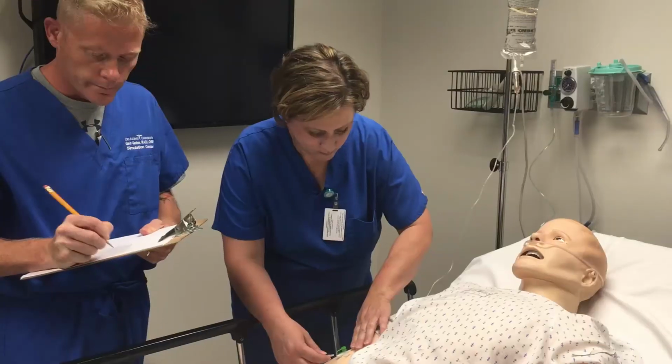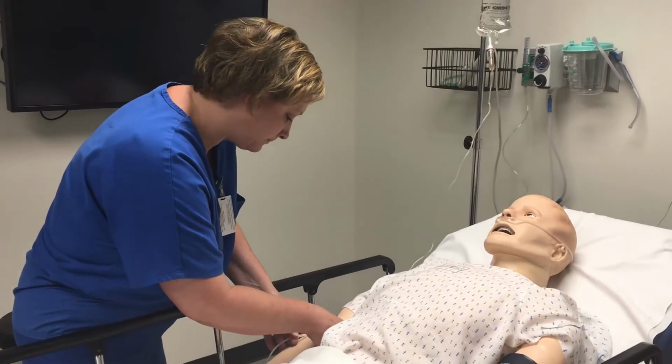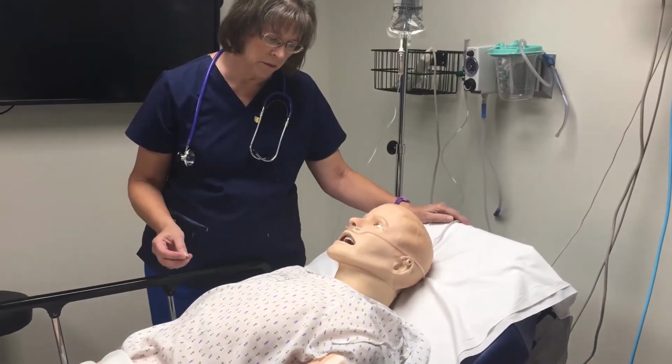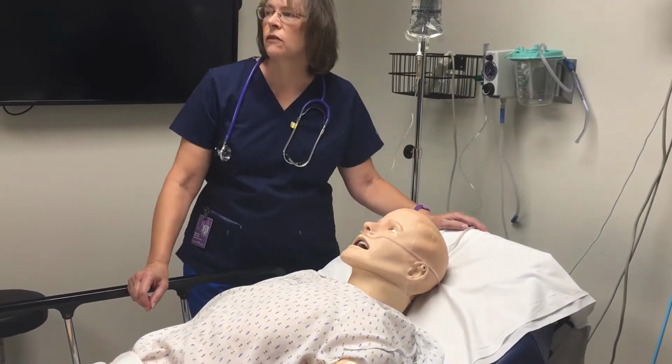Thank you. Thank you, sir. All right, sir, you're gonna feel a slight pull because I took your IV. Do we have everything matched for medication? Andrew, I have 4 baby aspirin I want you to chew up. Okay. As soon as I get you that, there you go. 12-lead going. Baby aspirin are given. Got it? Thank you.